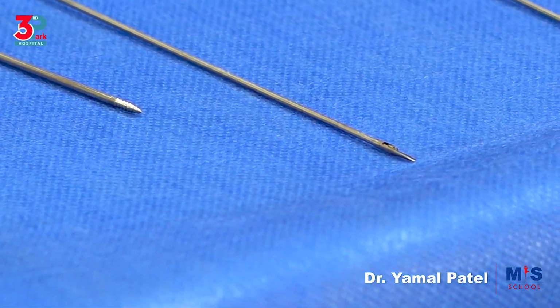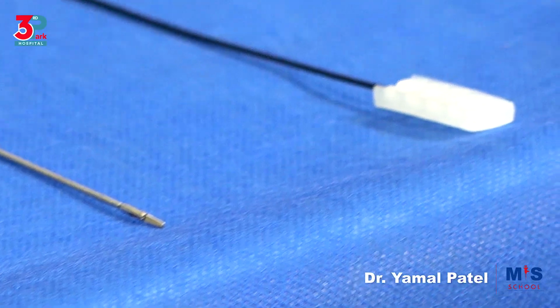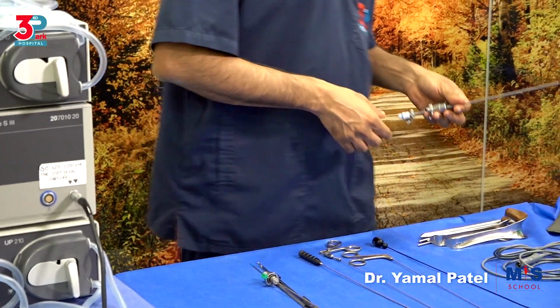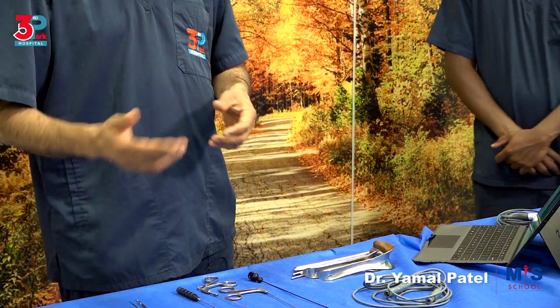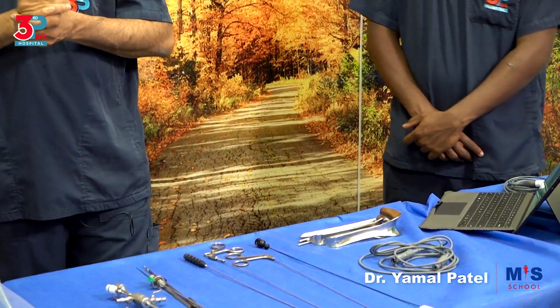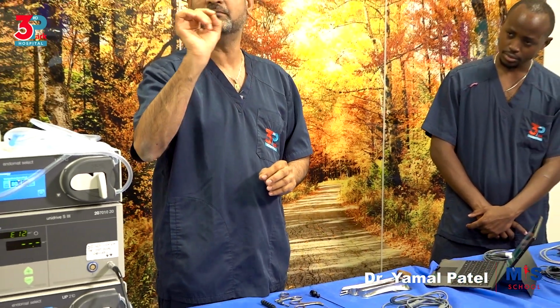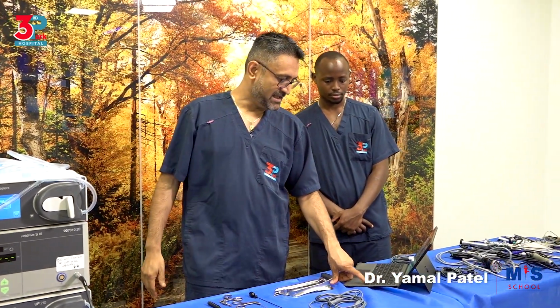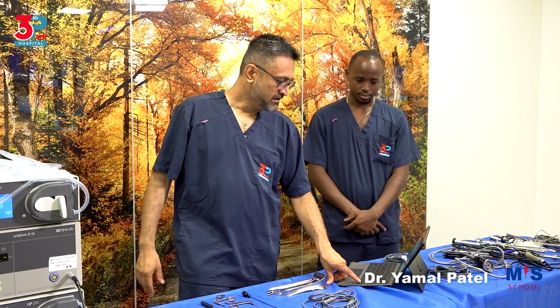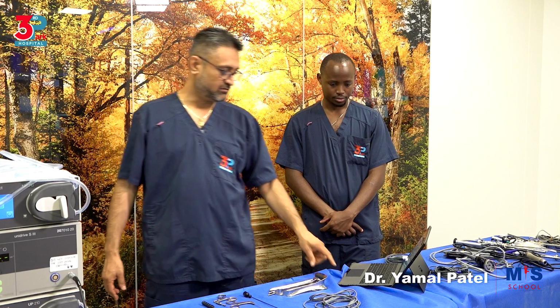I also have a 9 French instrument. This specific hysteroscope, not this one, this is the 5 millimeter. I have another hysteroscope that can allow a 9 French instrument as well. 9 French is 3 millimeter instruments, so it's a bit more sturdy and wider. So that's about our operating hand instruments.